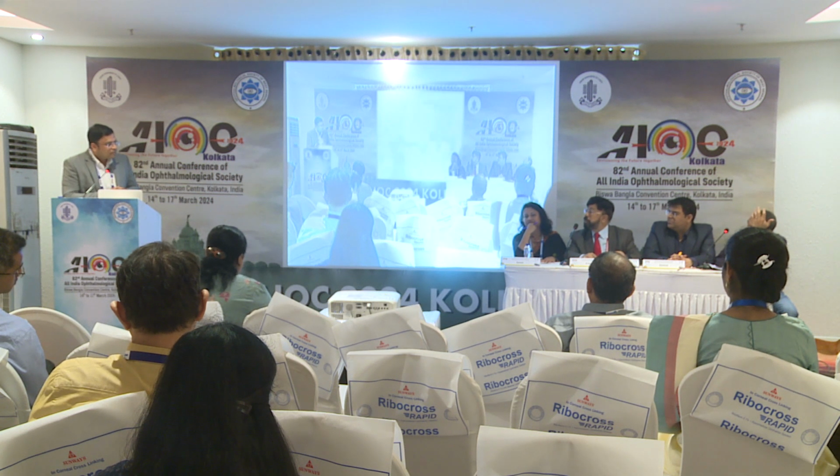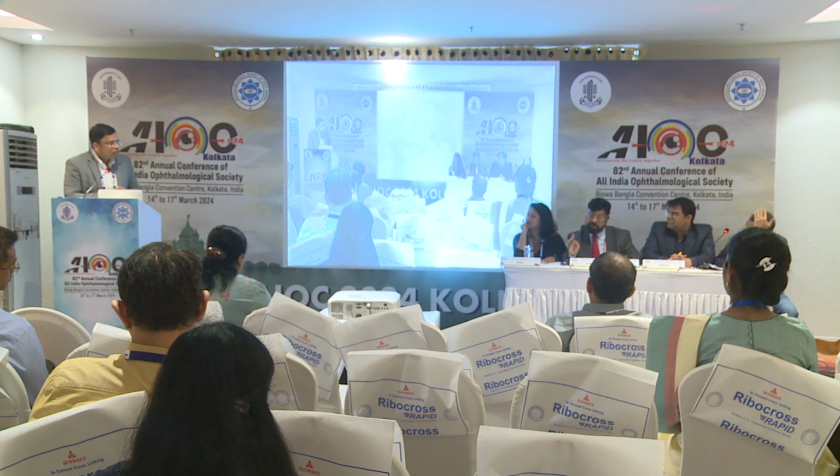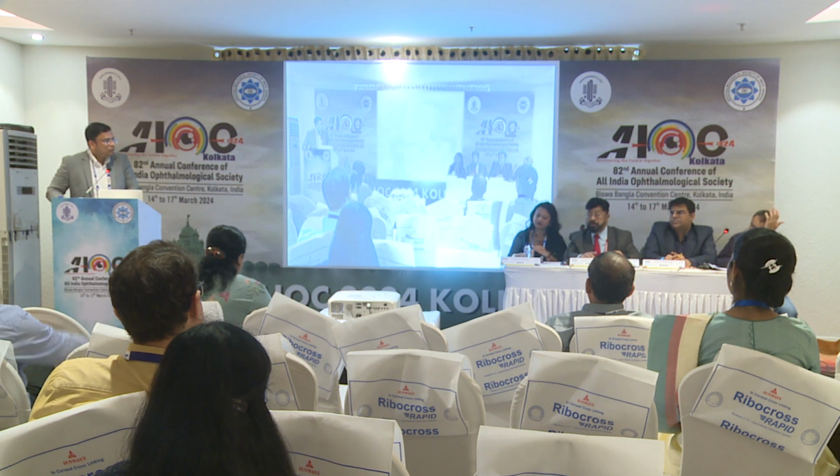Well, if there is no iris, aniridia, in these cases the intraocular pressure tends to go up. Number one. Number two, what I want to ask you is, why did you prefer a toric lens in these cases? Because you're never sure how the SFI will behave, whether it's going to have a tilt, whether you have proper positioning or not. So why did you go for the toric lens?